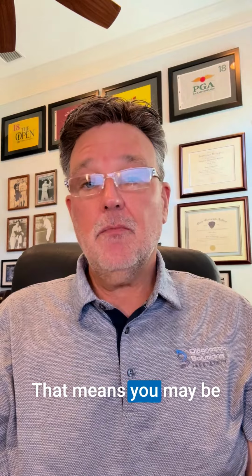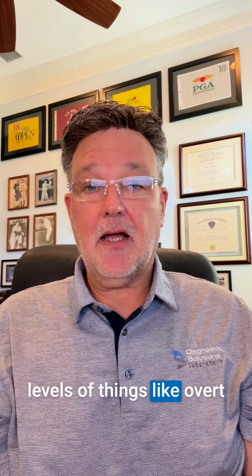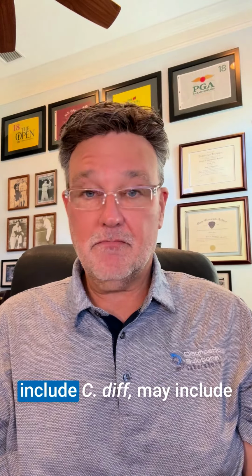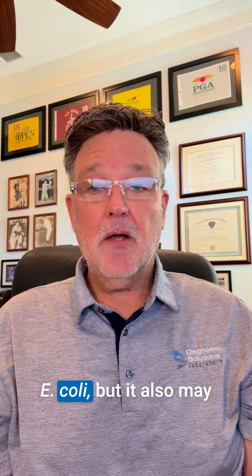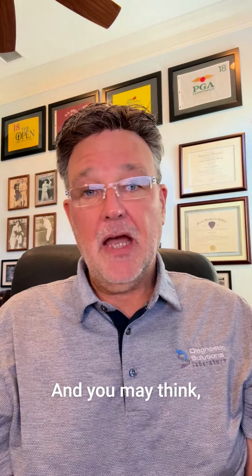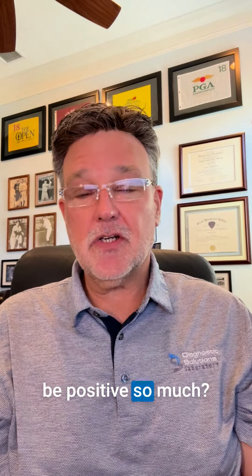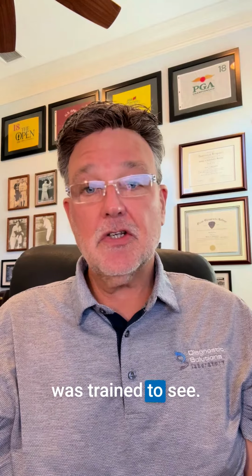That means you may be seeing results showing low levels of things like overt pathogens, which may include C. diff, may include things like pathogenic E. coli, but it also may include conditional pathogens like H. pylori. And you may think, how could these things be positive so much? I'm not used to this. This is not what I was trained to see.